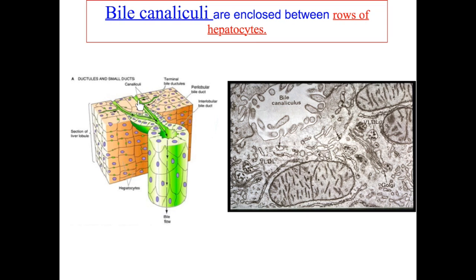We have the bile canaliculi. It has no specific lining. It is enclosed between the hepatocytes. Till we reach toward the periphery of the classic hepatic lobule, you will have here the canal of Herring. This is the canal of Herring, simple cuboidal. Why cuboidal? Central rounded nuclei, cuboidal cells, towards the periphery of the hepatic lobule.